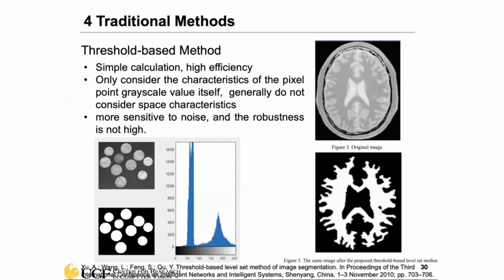So yeah, let's just briefly dive into these different classical methods, and then we'll move on. I'll talk in more detail about deep learning based approaches. So for the threshold-based method, based on the name, we set one or a couple of thresholds based on the pixel intensity.